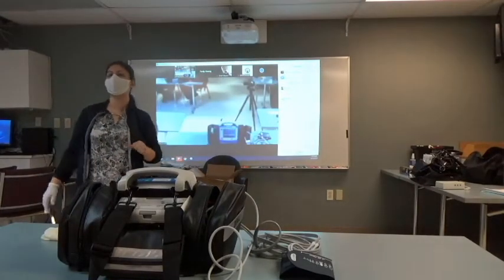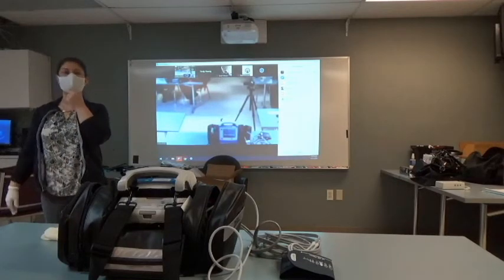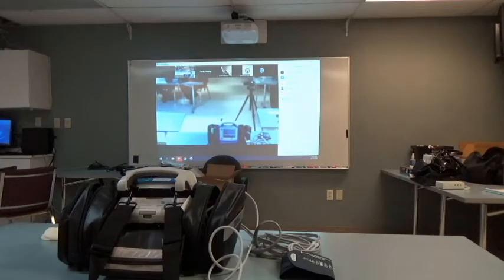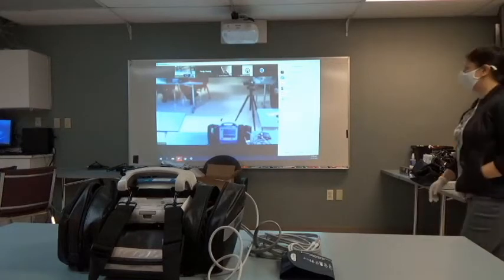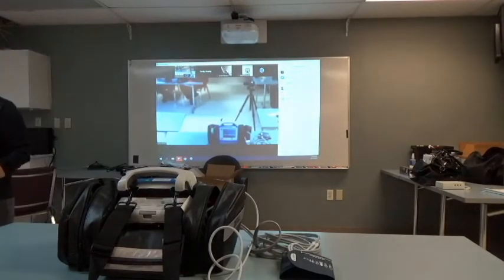For those of you that have a 12-lead cable, or a 12-lead rhythm generator, rather, find your 12-lead cable, connect to that, please. Is it in the back of the device?